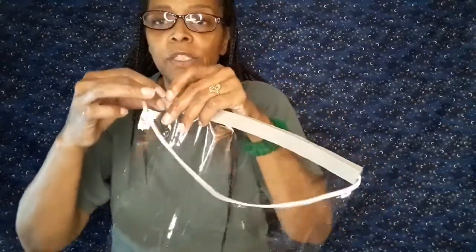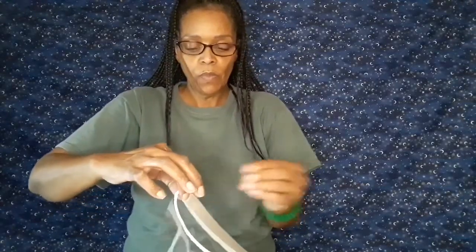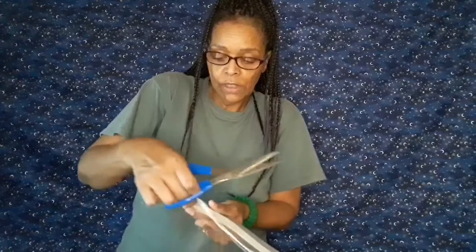And mash it. Mush it together and hold it till it's cool. Once it's cool, we will finish it off. But in the meantime, while it's cooling, this will be the time that you can go ahead, if it's too long on one side or the other, that's the time you can just take your scissors, eyeballing, and cut away the extra end.